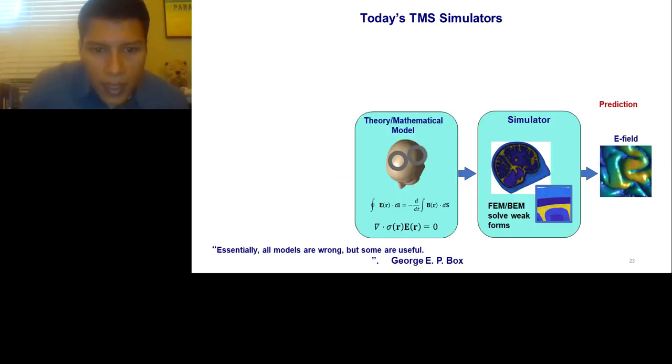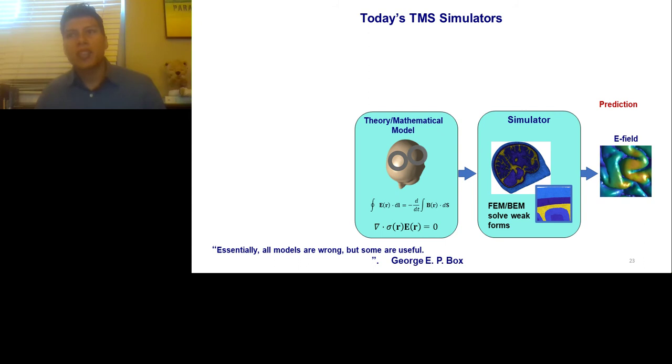It turns out that we just hit the tip of the iceberg. There's a certain level of uncertainty in all simulation results. However, this is the solver's viewpoint. You give it an input scenario, and it gives you a prediction, while neglecting that reality is really messy. You rarely see an experimental result without some kind of error bars or some estimate of uncertainty, whereas with simulations, oftentimes you just get a single deterministic output. To increase the realism of our simulations, we must take into account all of these inherent contingencies. And my brain research project addresses this need.